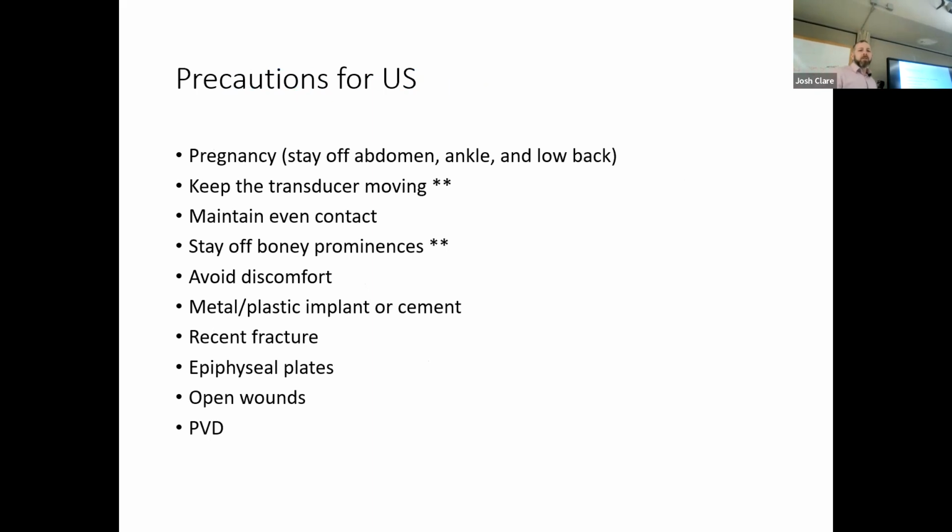Precautions. Again, I put precautions in pregnancy as well, because some textbooks say pregnancy is an absolute contraindication. Others say just stay away from the abdomen, ankle, and low back. One textbook I looked at said stay away from the ankle because there's an acupuncture point in the ankle that could induce contractions. I only saw that in one textbook.